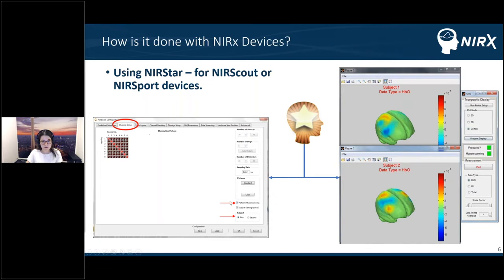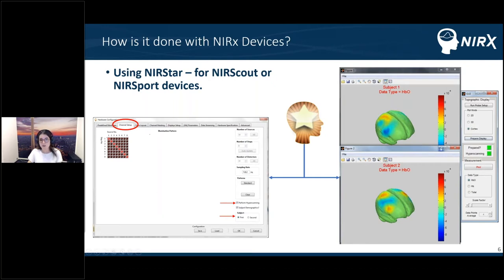In the channel setup tab, you need to enable the 'perform hyperscanning' checkbox after loading your chosen montage. You can then select different features for the first and second subject. Once this checkbox is enabled, the hyperscanning tab will turn green, and you'll be able to see a 3D display as a standalone GUI which will plot hemoglobin concentration values in different 3D setups.